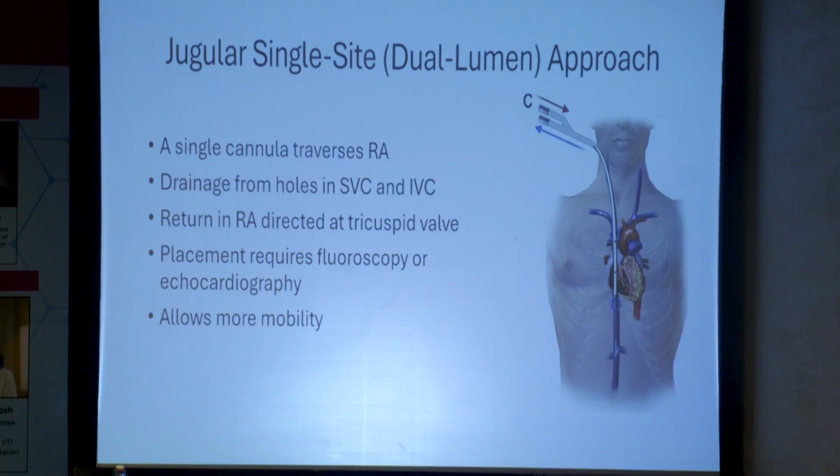And this is the same thing that Kapil was asking about brachiocephalic. So if I am cannulating the left side, my sphincters are extra tight. All you need to do is follow the guide wire, and we do it bedside. And you're gradually advancing the catheter, or if it goes straight into the brachiocephalic, we are toast. And the patient is toast too.